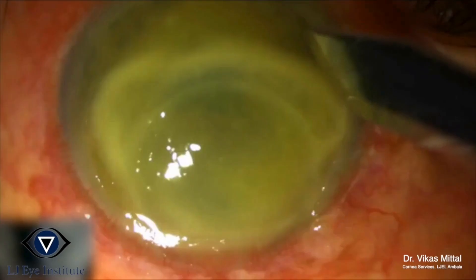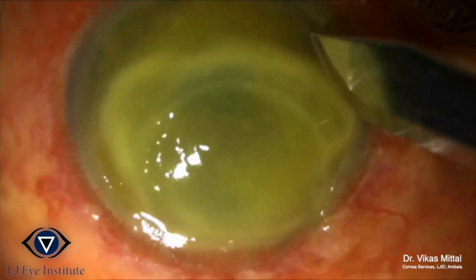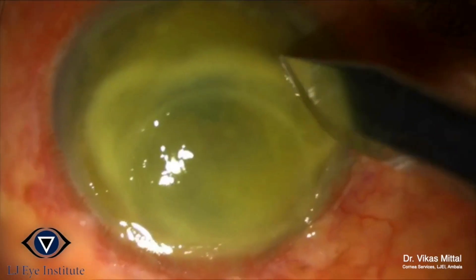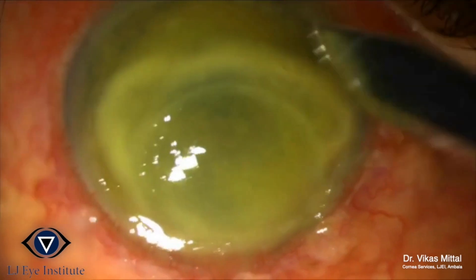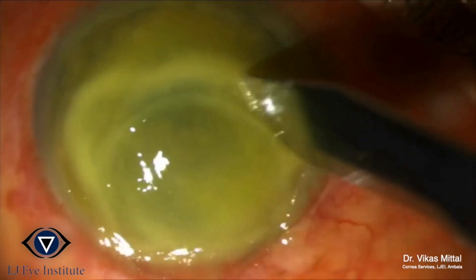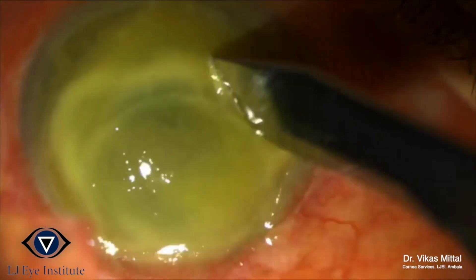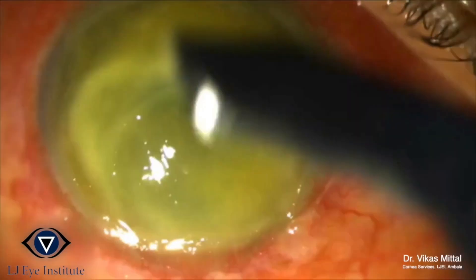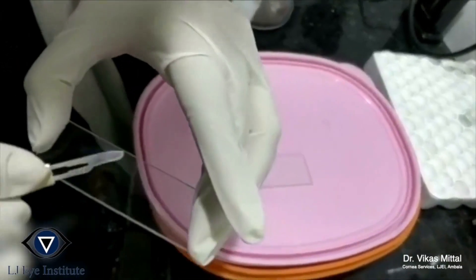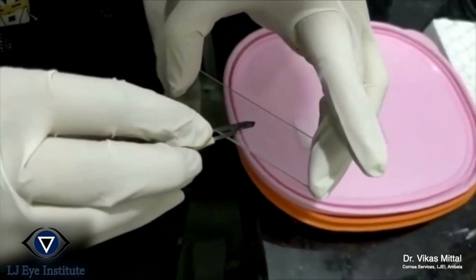A 15 number blade is used for scraping. The sharp end of the blade is used to scrape the edge of the ulcer, and the material is smeared on the slide for gram stain.